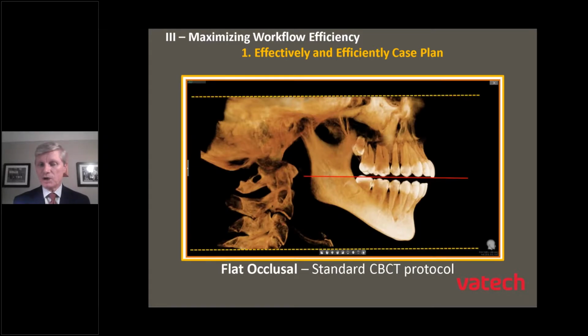So now the condyles are well below the top border of the scan, which is essential. If you're doing airway assessment, very often you need to be able to see the condyles, airway, the epiglottis, to be able to measure the entire airway. But this is the standard patient positioning for doing CBCT in your office. I stress this here because it's probably the top inconsistency that we come across when it comes to image capture that can really create problems in terms of trying to verify that you captured the intended region of anatomy and making it easier for you as a clinician to treatment plan this.